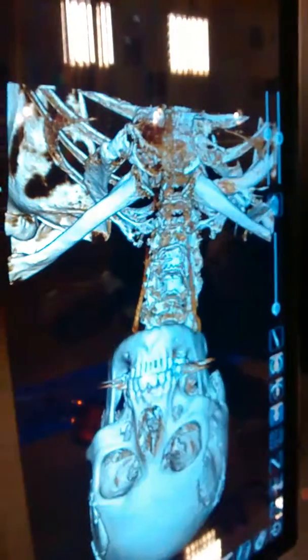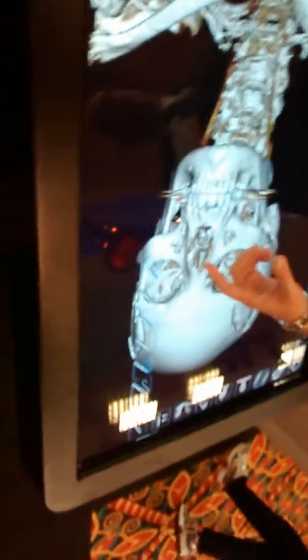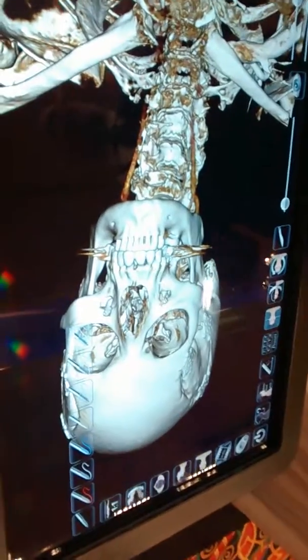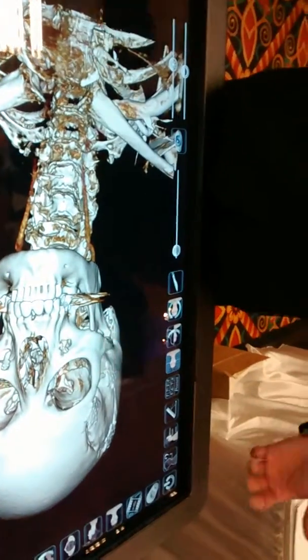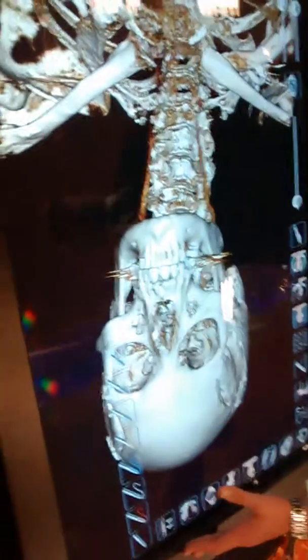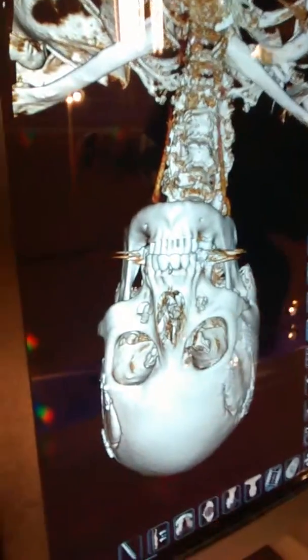So also, if you open it up for student use, at any time students can come and create reference images. It'll take still images of whatever's on the table at any time. They can export it out. We have USB ports here. It's fully accessible by network. It's essentially a very powerful PC, and anything that you can do on a regular PC, you can do on the table as well.